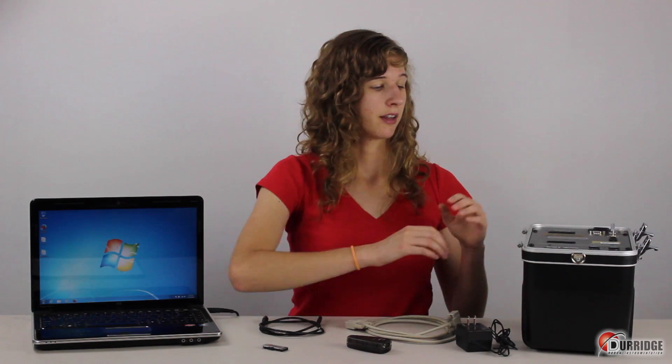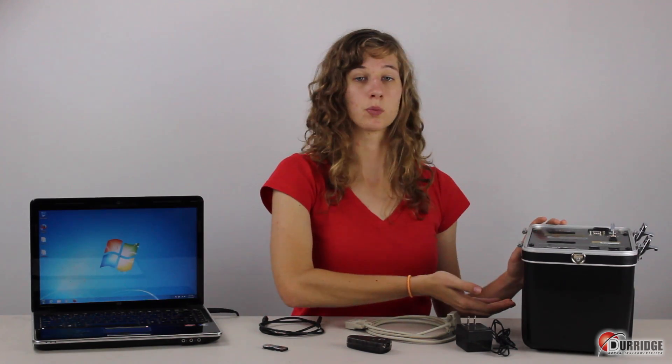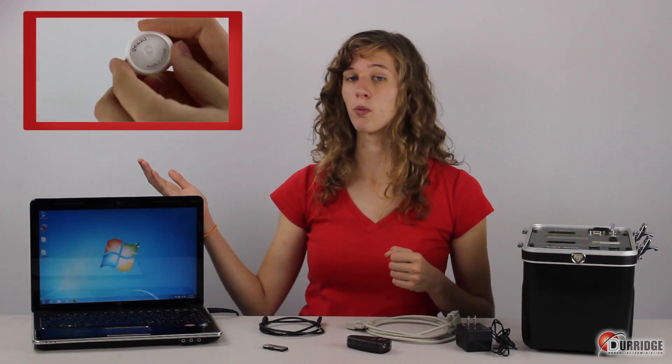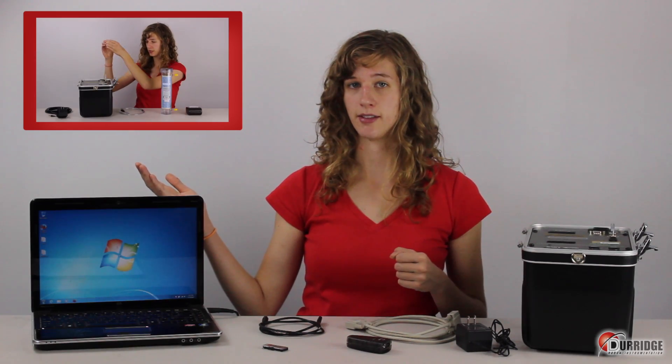Here is the equipment that you need to connect to capture. This is the RAD7 with at least one completed test contained in its memory. To learn how to run a test, you can watch the video tutorial, Getting Started, running a one-day test with the RAD7.